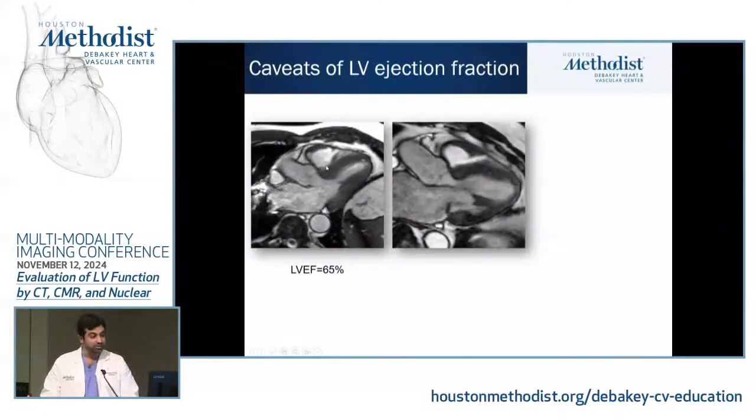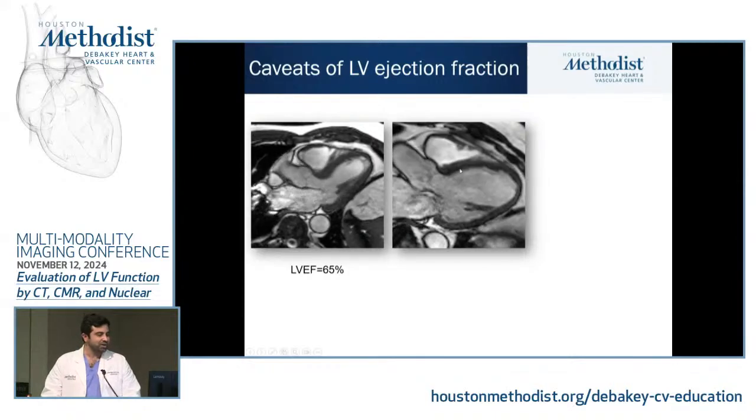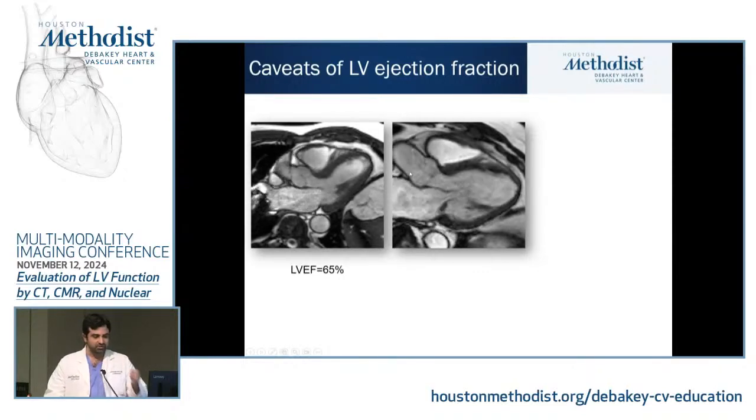It may appear thick because you're looking at it primarily in systole, but if you pause it during diastole and measure it, it's still within normal. I'm going to recheck after you told me this. What about the person on the right? So you're correct that this heart looks significantly larger than this. And then what else do you see?